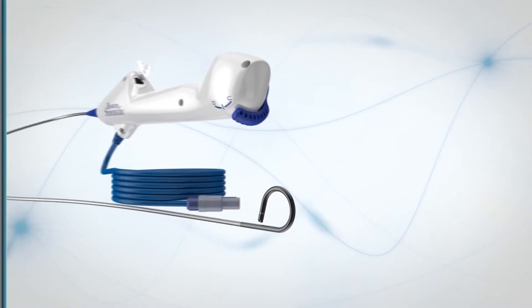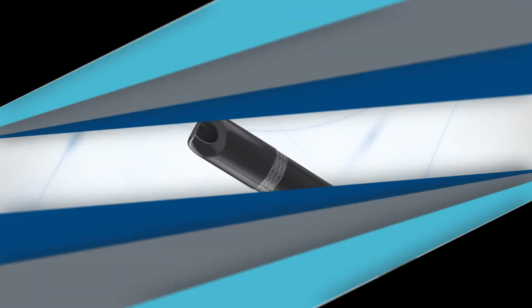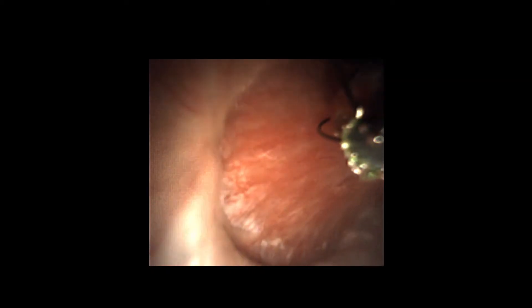The power of the LithoView FlexScope starts with the digital chip built into the tip. It delivers a digital image and seamless navigation for your most challenging procedures. These images are comparable to those you've achieved before, but since you're using a new scope for every patient, there's no risk of image degradation that often occurs with reusable fiber optic scopes.